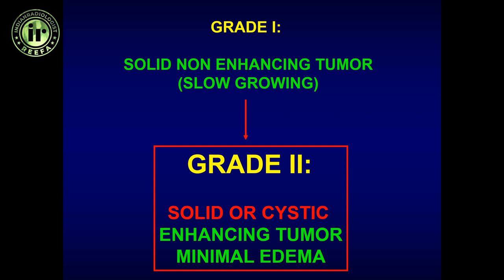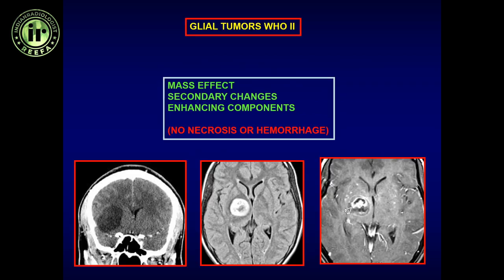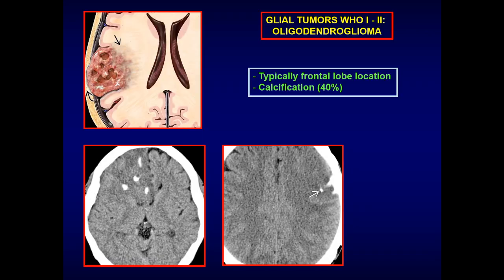What makes Grade 1 become Grade 2 on imaging is basically that we start seeing enhancement in the tumor. Otherwise the tumor looks the same — low T1, bright T2, no necrosis, no hemorrhage — but we start seeing enhancement and there might be some peritumoral signal abnormality. This would be a Grade 2 neoplasm: no necrosis, no hematoma, no significant mass effect, very narrow zone of transition, but enhancement present on post-contrast imaging.